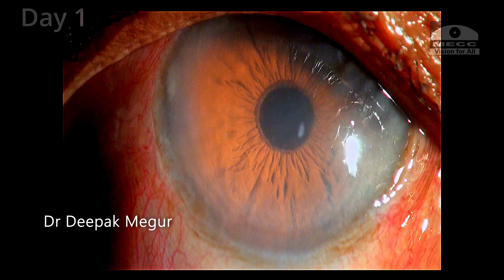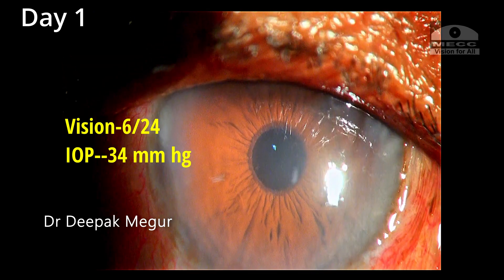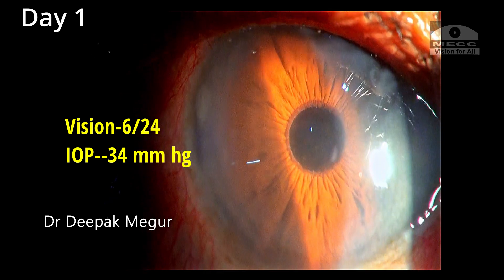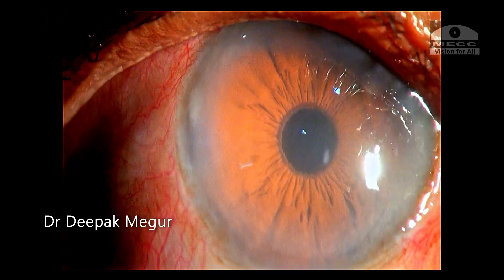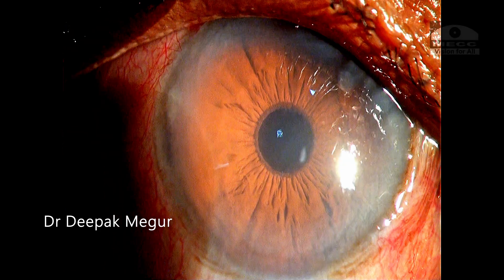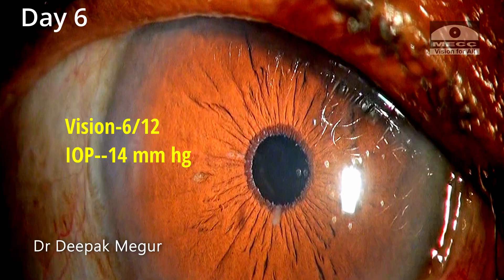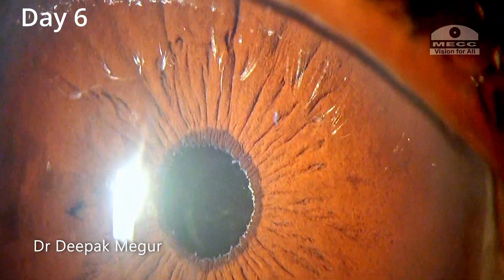On the first post-operative day, there is slight corneal haze and the intraocular pressure is 34. We must remember that this eye had pseudo-exfoliation, so a compromised outflow facility is to be expected, and the IOP has also likely risen due to some retained OVD. The patient is treated with anti-glaucoma medications along with steroids. By the sixth day, the cornea has cleared and the pressure has dropped to 14. However, this patient will be monitored for life for the development of glaucoma.